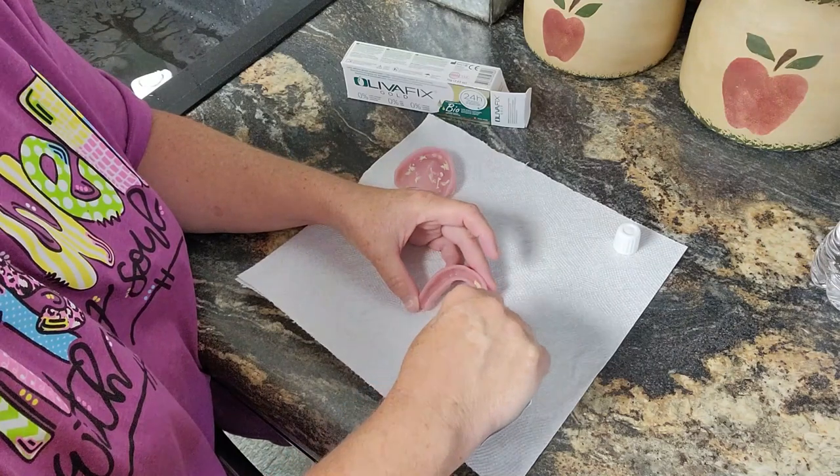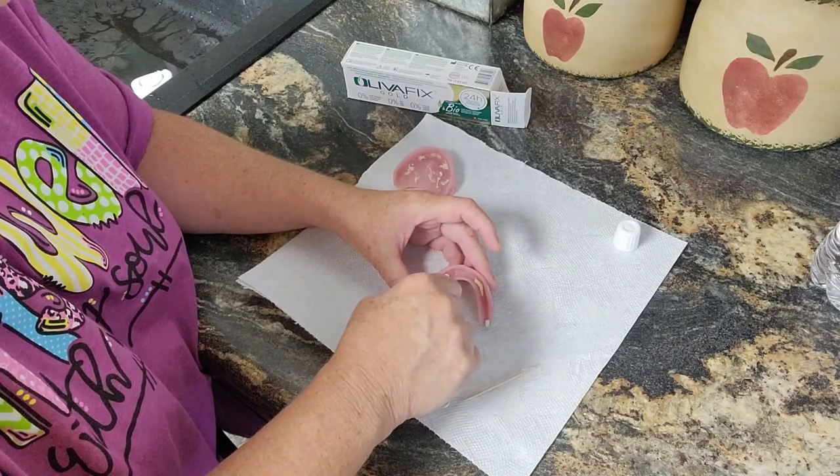It was really easy to remove the denture adhesive off my gums. This is my life — that's what I'm feeling in my gums.